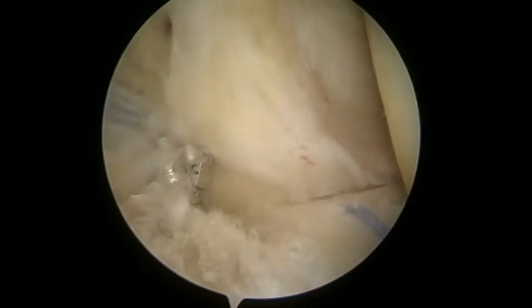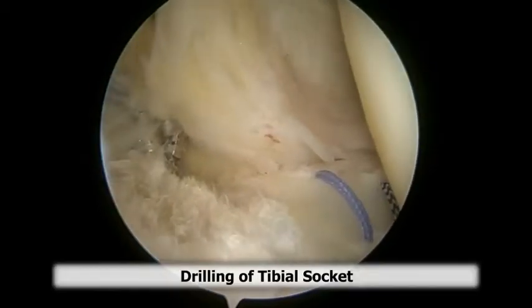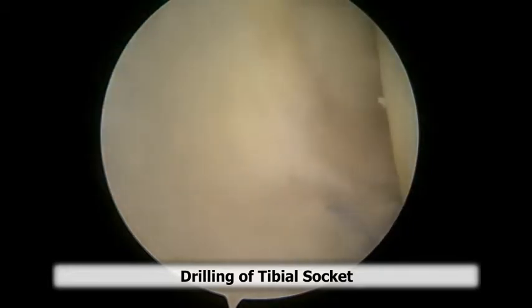Next, you can see we start our flip cutter off of the bone, and we drill our tibial socket in retrograde fashion using the flip cutter.